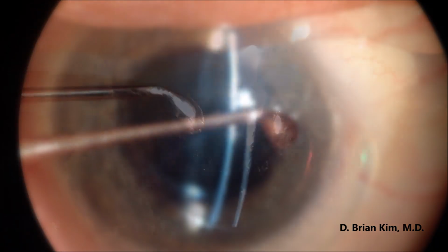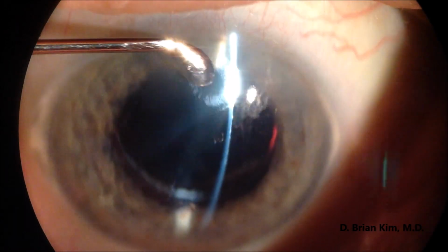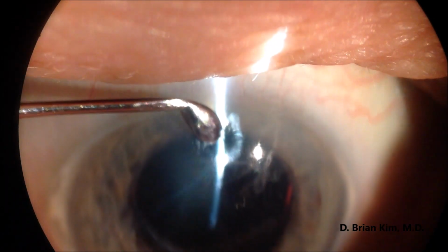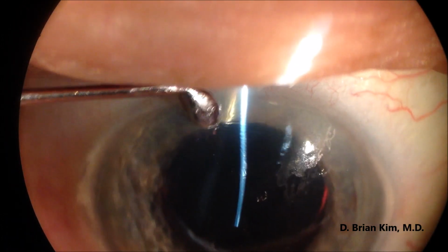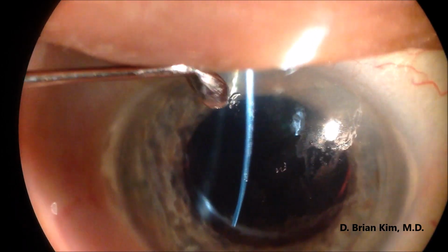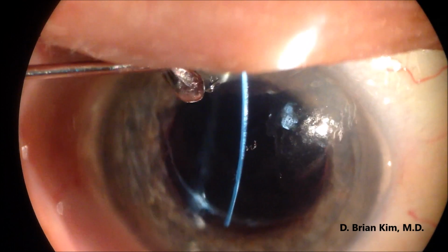But when you check right here, let's see, you check right here. There's one spot. Where did it go? Right there, see? Right here. She has it right there. A loose epithelial defect right there. So that is the erosion. You would otherwise not see it.